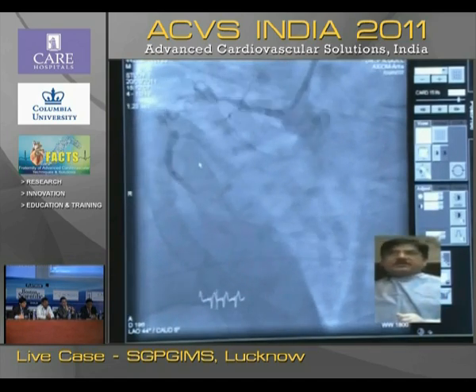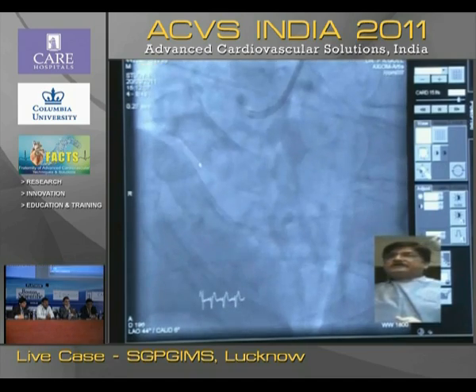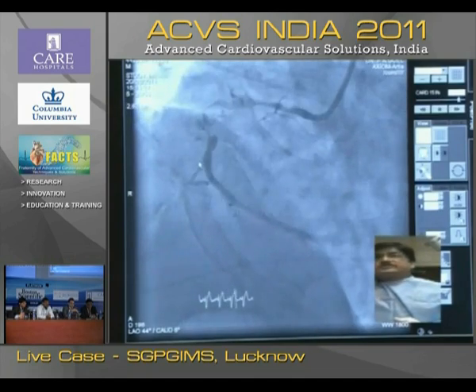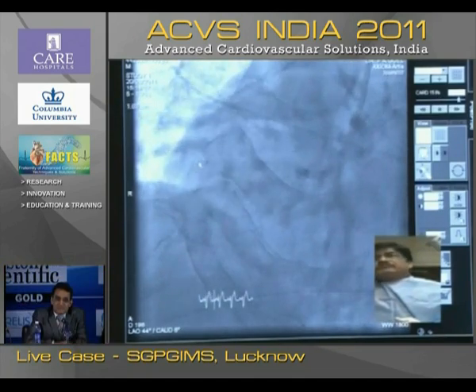Okay, and that's the right coronary. Okay? So, do you have any thoughts? You want to suggest something to me? Yeah, it's the right kind of lesion for a guy like Goel.